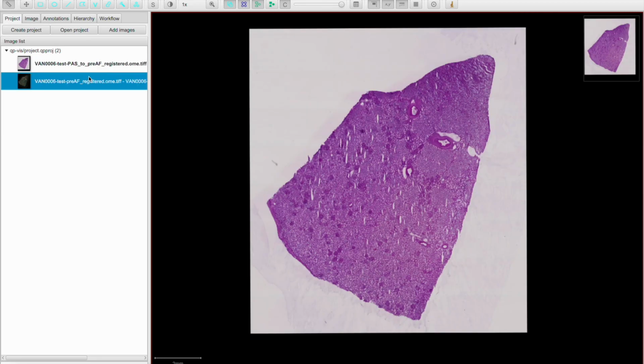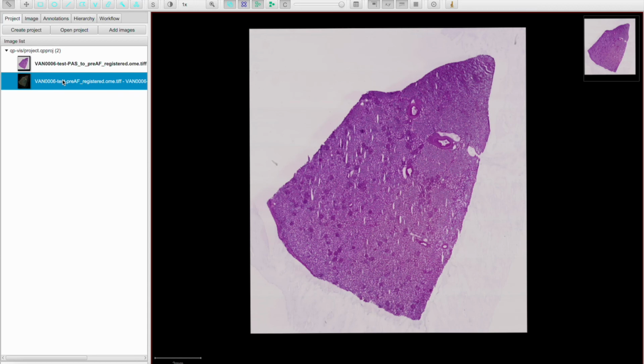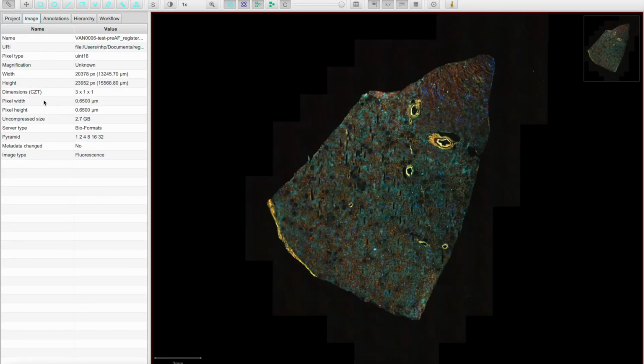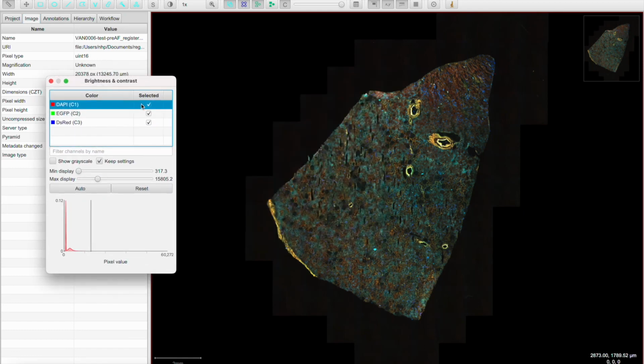And so we can go back and forth. It has both RGB images and the fluorescence, autofluorescence image, and it maintains both the pixel width and some of the metadata, as well as any channel names that we added. The channel names that you set in the GUI or when you configure the graph are saved into the output OME TIFF.